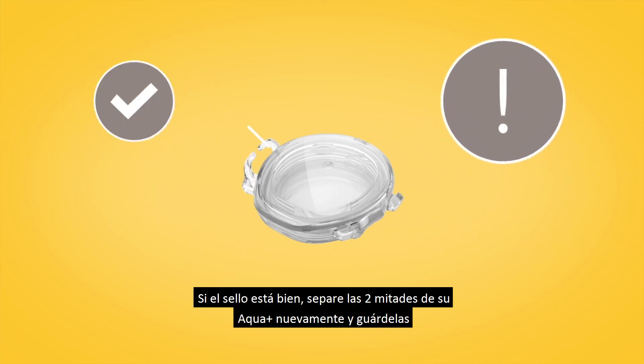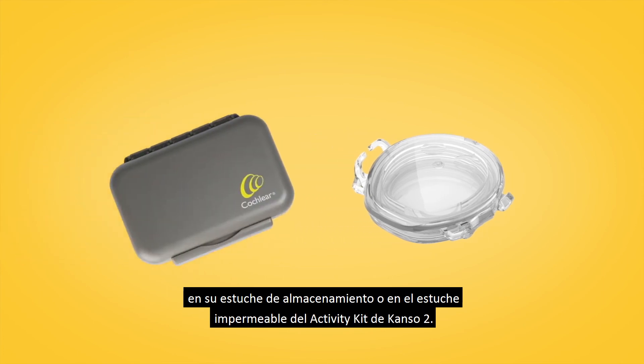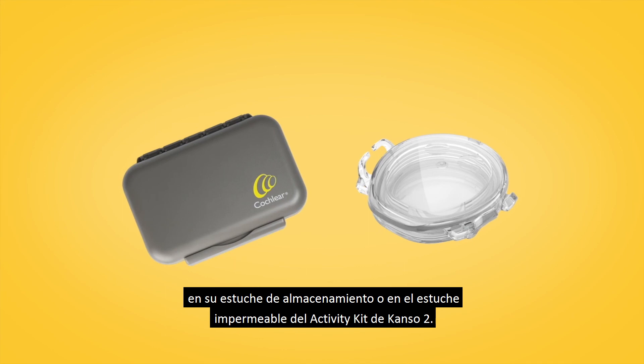If the seal is okay, separate the two halves of your Aqua Plus again and store them in your storage case or the Canso 2 Activity Kit's Waterproof Case.